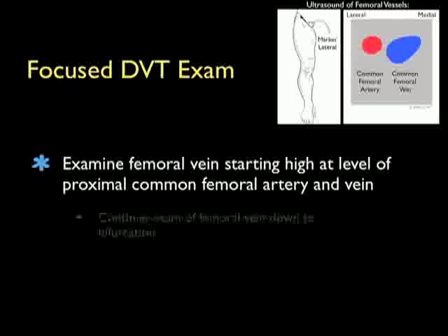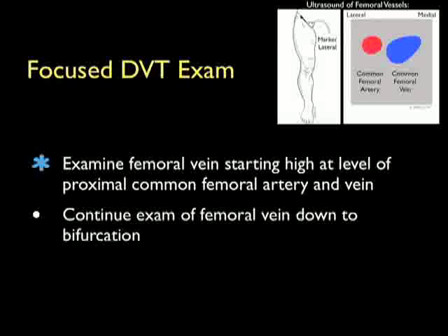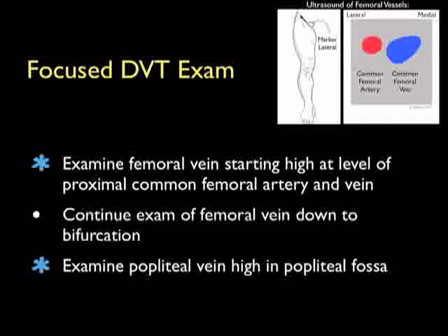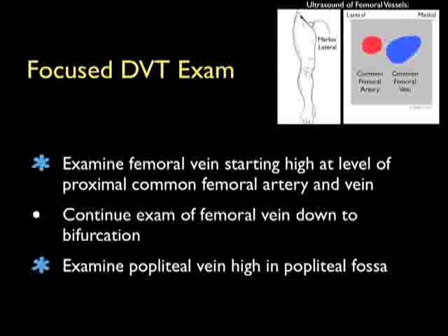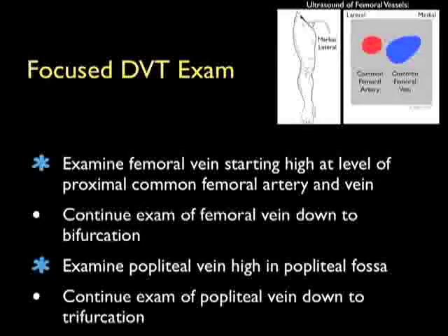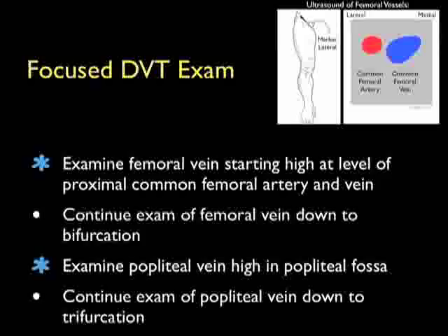In the focused DVT exam, we'll begin by examining the femoral vein starting high at the level of the proximal common femoral artery and vein, just below the inguinal ligament. We'll continue the exam of the femoral vein down about four to five centimeters through to bifurcation of the vein into the deep and superficial femoral veins. We'll then turn to examination of the popliteal vein, placing the probe high within the popliteal fossa, examining down to trifurcation of the vessel into the calf veins.